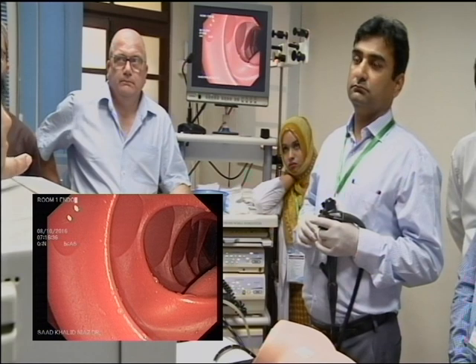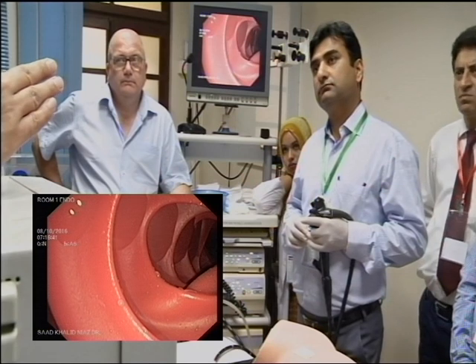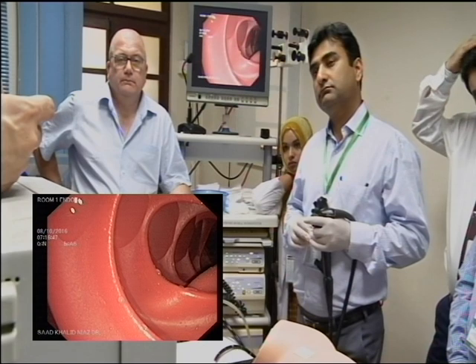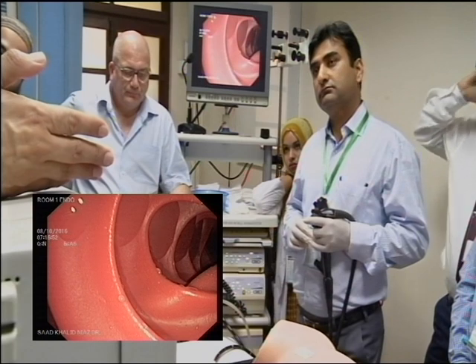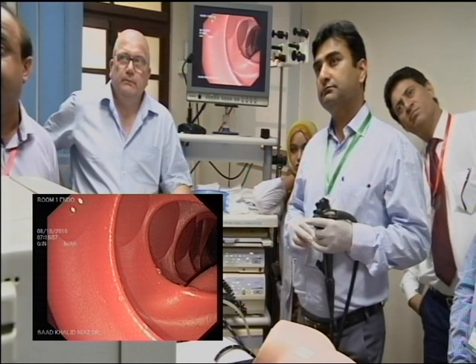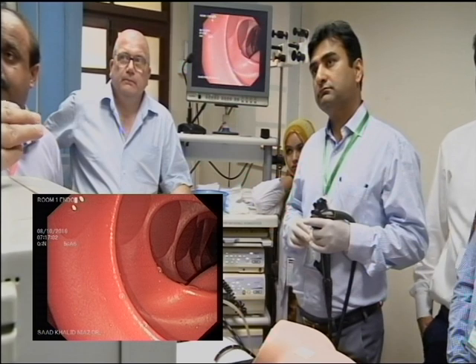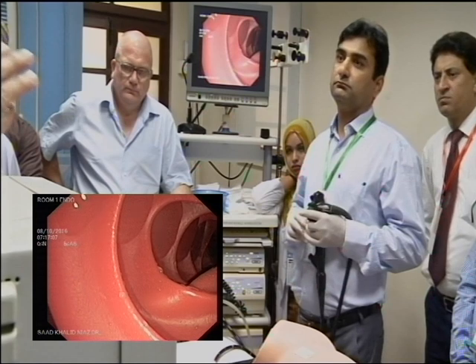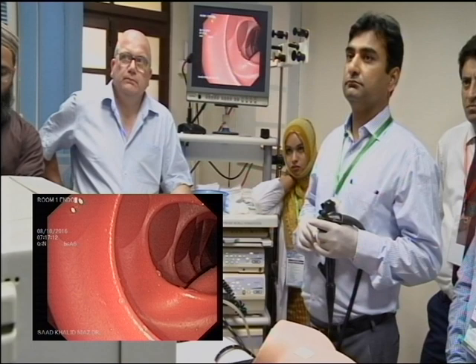There is no maturity in saying that I can reach the cecum in 2 minutes. And everybody at some stage in their life can. As long as you're safe, you do it comfortably for the patient, and you speed up later on. But the slower you are, especially in the first few minutes of your colonoscopy, just negotiating the left side, the less likely you are to harm the patient, it's going to be less painful, and it will make your colonoscopy very easy. So I think it's very important to be slow.